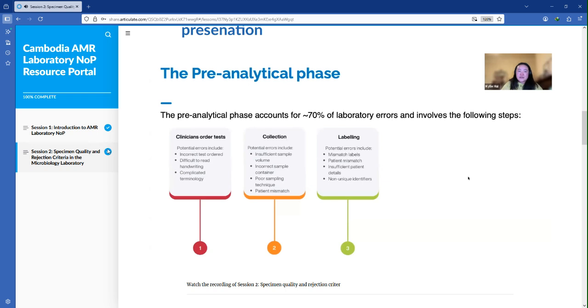So when you add everything together, if your ending score is equal to or greater than 1, this will be acceptable and it indicates an active inflammation sample worthy of culture. If it's a score of less than or equal to 0, it's unacceptable, and that would indicate contamination with saliva.